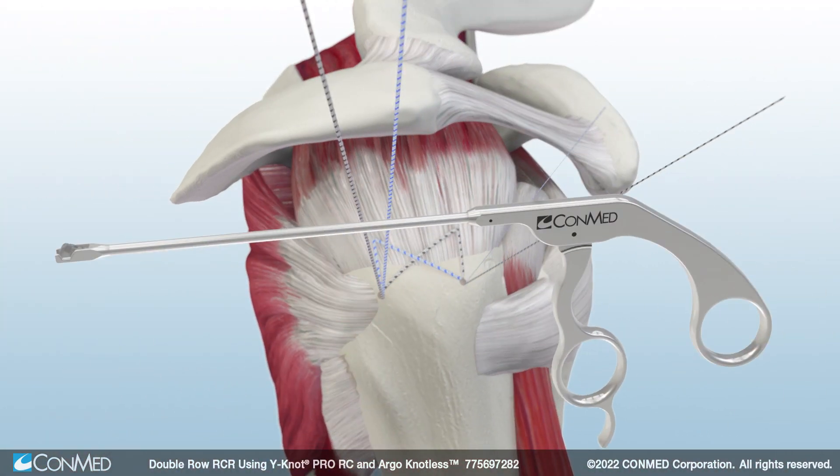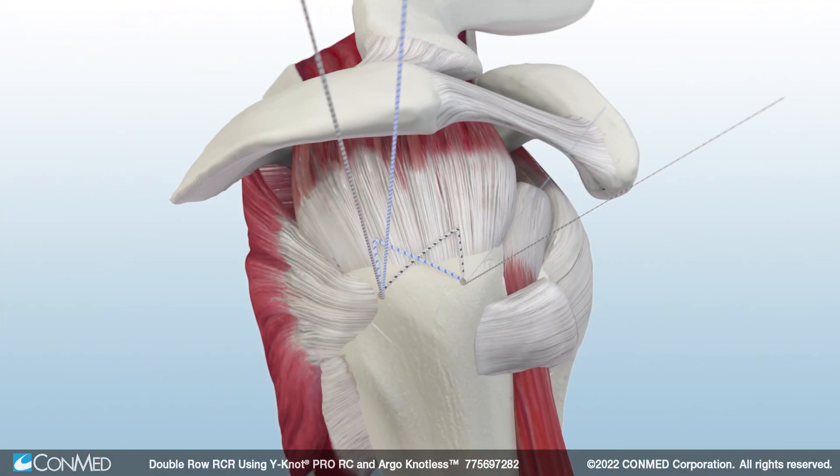Finally, use the Katana Flush Cutter, which can cut up to two limbs of No. 2 Hi-Fi Suture, Hi-Fi Ribbon, or Hi-Fi Tape to complete the double-row rotator cuff repair.